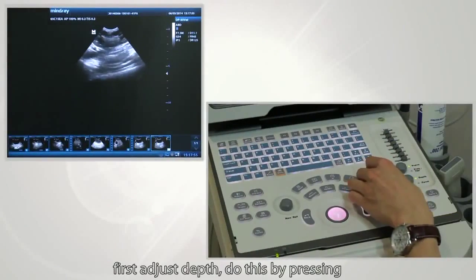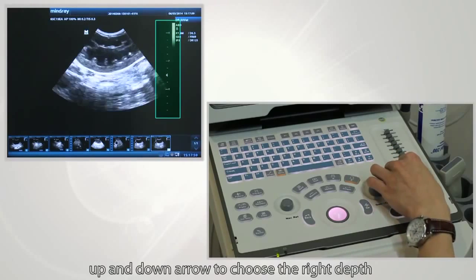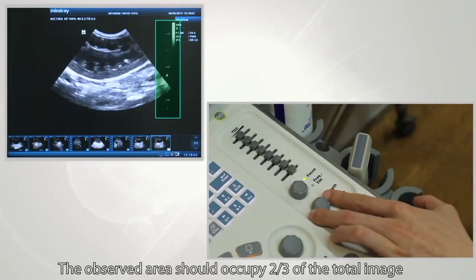First, to adjust depth, press the up and down arrows to choose the right depth. The observed area should occupy two-thirds of the total image.